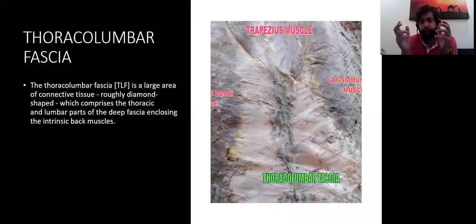the treatment, the IASTM strokes you can give are exactly the same as the way you treat the erector spinae. In the erector spinae, you have to be closer to the area. You have to find the muscle girth, see the orientation of the muscle, and then stroke it accordingly. In the thoracolumbar fascia, again, you have to see what the original insertion is, from where it is connected, what all areas you need to treat.